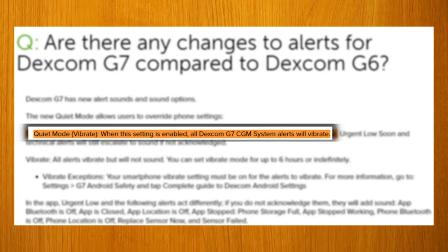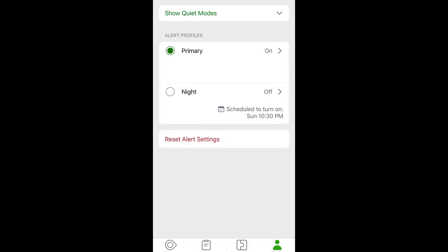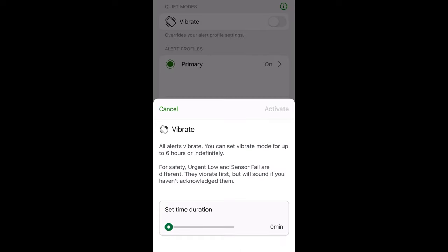One of the biggest upgrades that I think a lot of people were waiting for was the changes in the alarms — they added some alarm flexibility. The new G7 allows you to access what's called quiet mode, meaning all alarms are turned to vibrate, even the urgent low glucose alarm. So anytime you're in a meeting or taking a test, you can just hit quiet mode and it'll turn all alarms to vibrate.